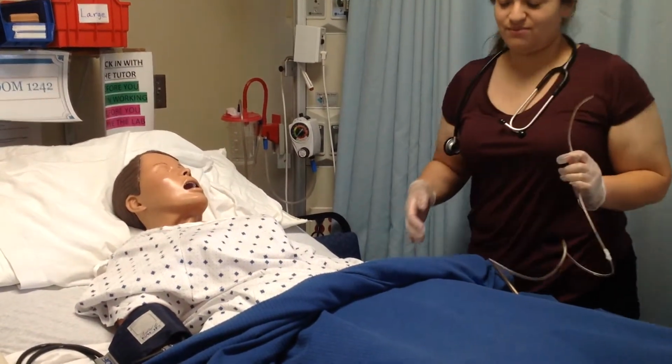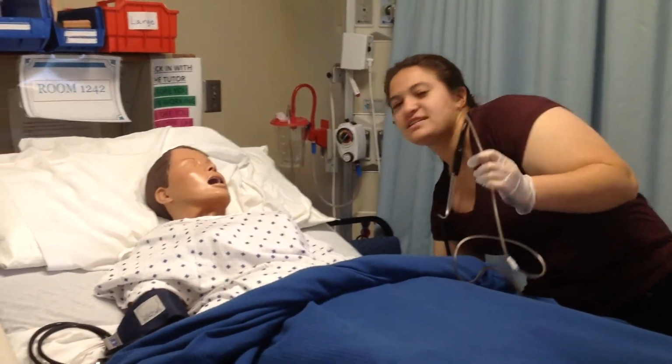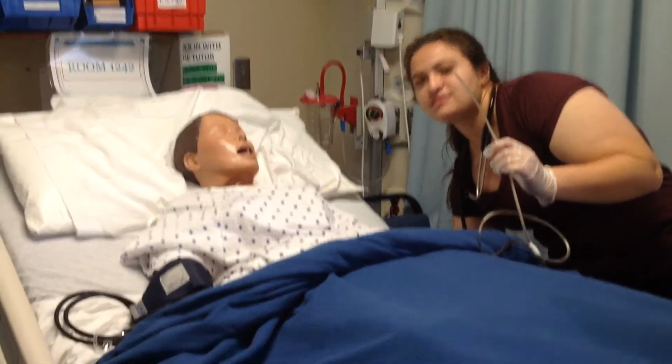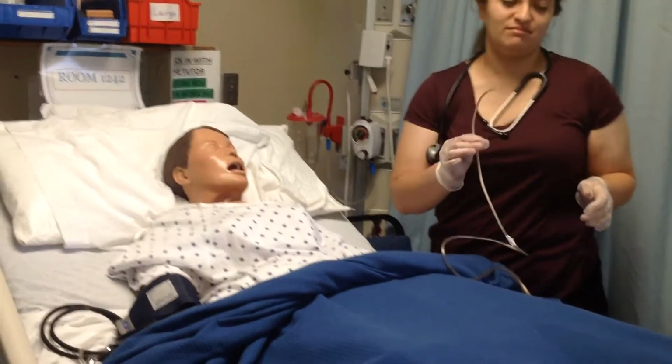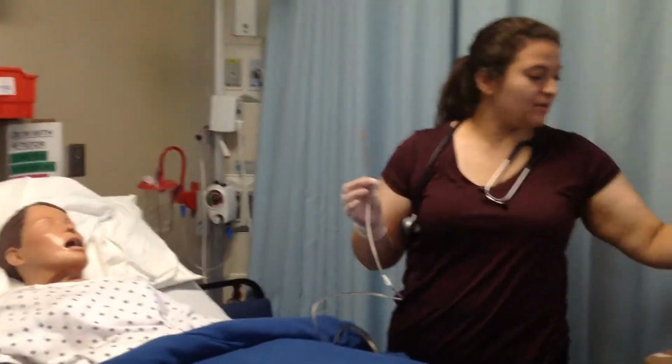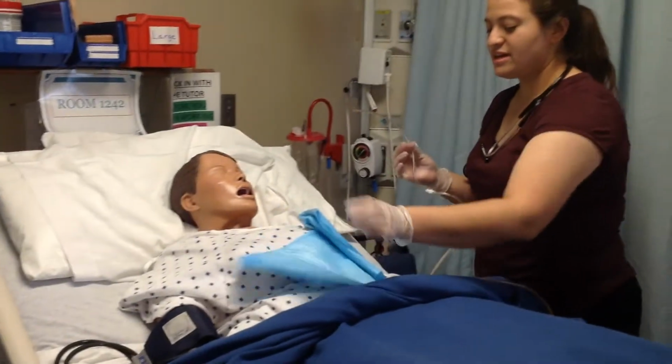That's good. So I just want to make sure the patient is able to be in a good position while doing this. So then I would go ahead and take my blue pad and put it over the patient.